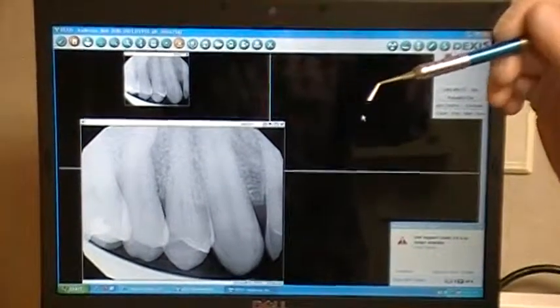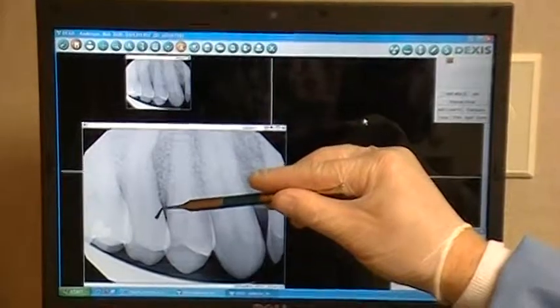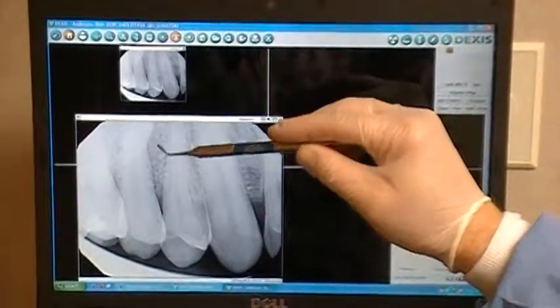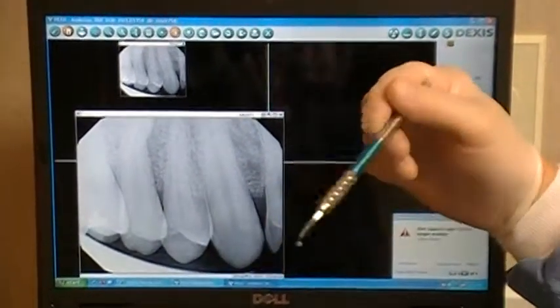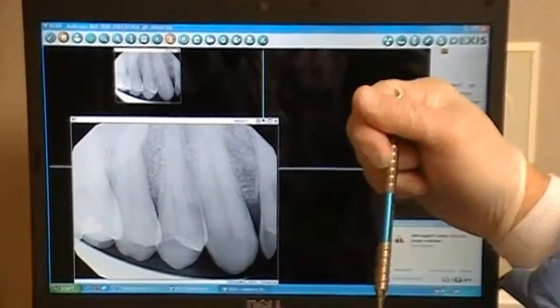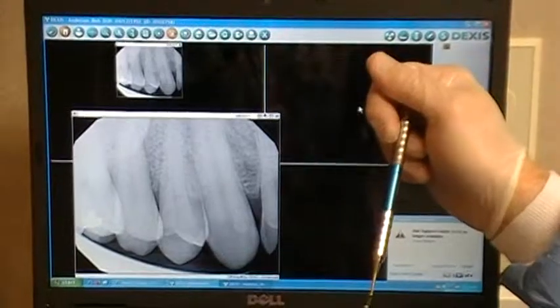Today we have a patient who presents to our office in an emergency situation with a failing maxillary right second bicuspid, tooth number four. The radiograph indicates an angulation on the root, and we also have a fracture in this tooth. We want to take this tooth out as atraumatically as possible, and to do that we're going to use the physics forceps — the maxillary right physics forcep — to extract tooth number four, with the hope of placing an immediate implant today.